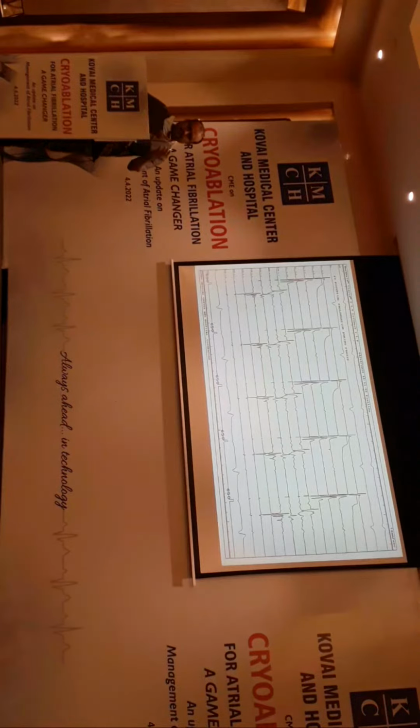We know very well, there's an excellent paper from Haissaguerre which clearly says, they identified, the most common triggers for AF come from the pulmonary veins. So in AF ablation, the most important step in achieving sinus rhythm, or keeping the patient in sinus rhythm, is having a pulmonary vein isolation. So you have to isolate the pulmonary veins electrically from the left atrium. This is the basics of AF ablation.